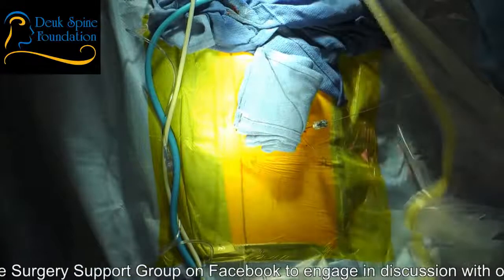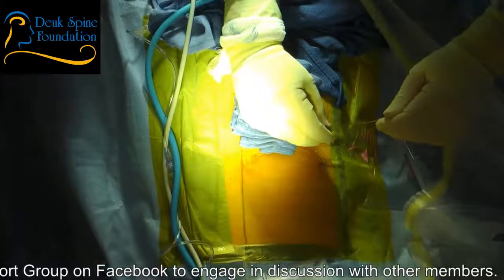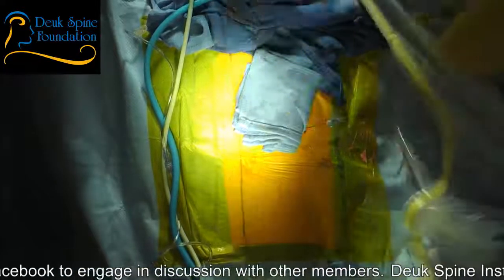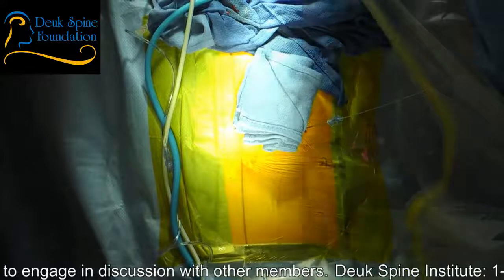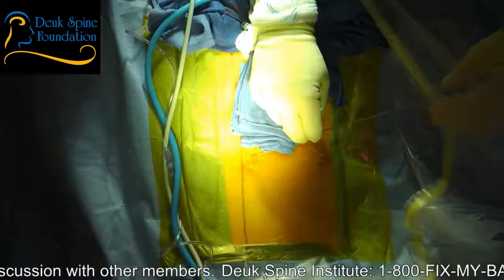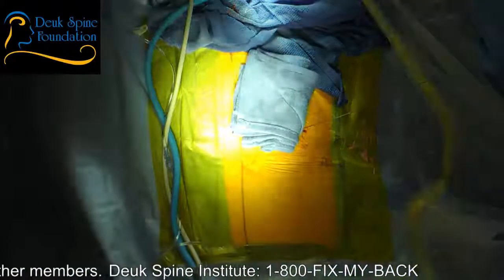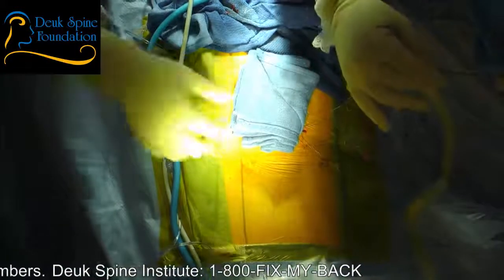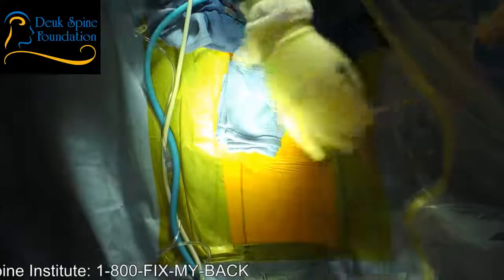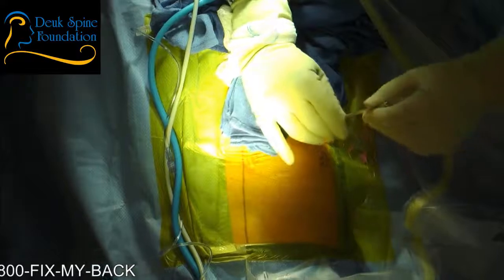Shot? All right. So I've got the guide wire in position. I'm going to remove the needle. And I'm going to keep the guide wire where it belongs, in the disc. The guide wire will guide the dilator. The needle that I placed earlier is the pathfinder. The guide wire is merely a guide left behind by the pathfinder.